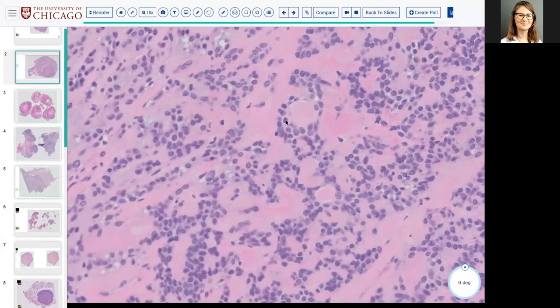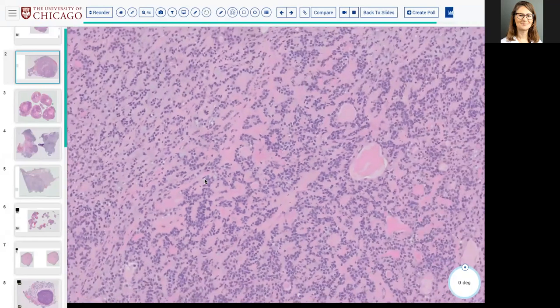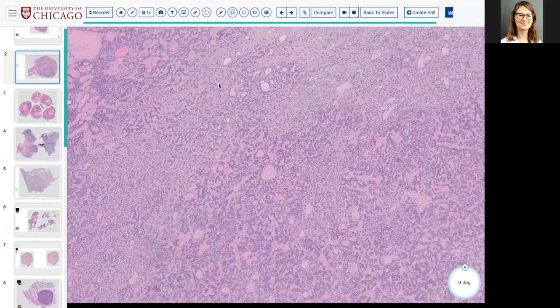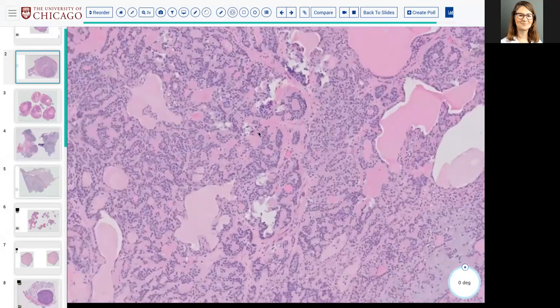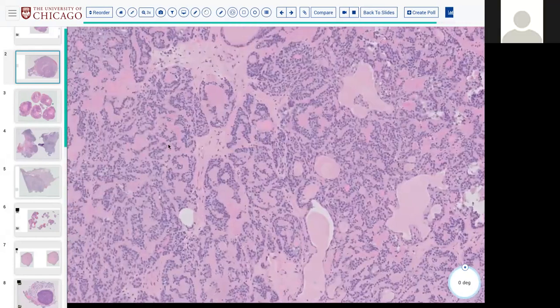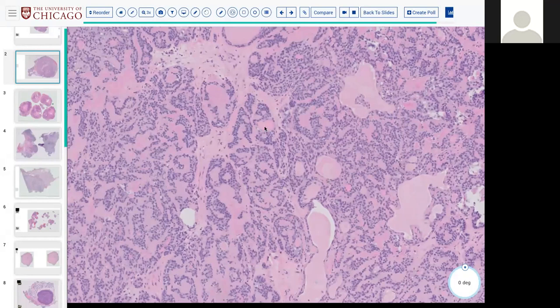So I would argue that perhaps you might be appreciating these more epithelial pink ducts surrounded by these other cells, which you might regard not necessarily as super morphologically different, but as architecturally different in their placement, in their geography around these ducts. So does that color your final thoughts then? Yeah, then I'd be more thinking of a PA. Yeah.